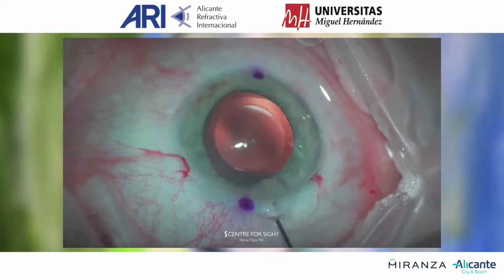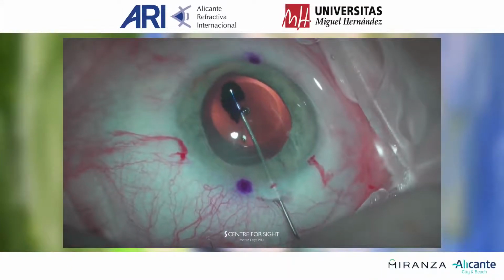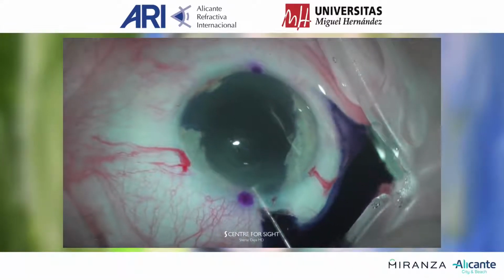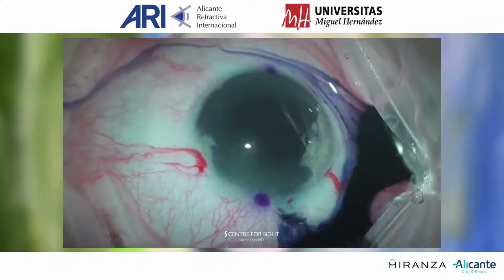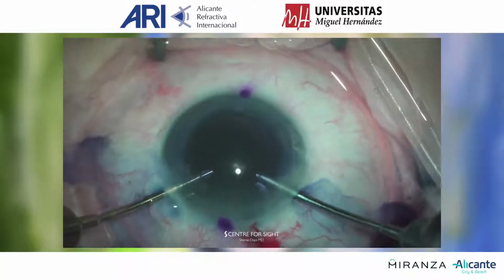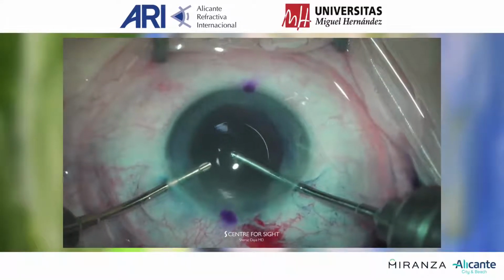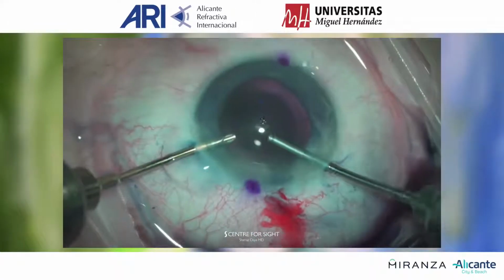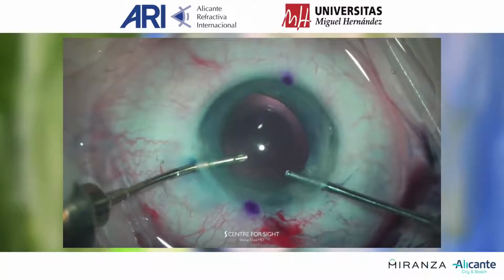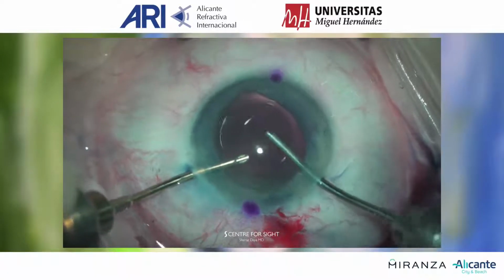And now trypan blue for the Capsulaser portion of the procedure is injected under the ICL. This is quite a heavy liquid and stains the capsule uniformly. Following a minute, the trypan blue is removed using irrigation aspiration. And once this has been accomplished, then the ICL can be removed.